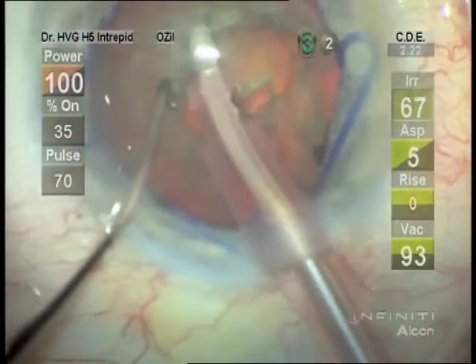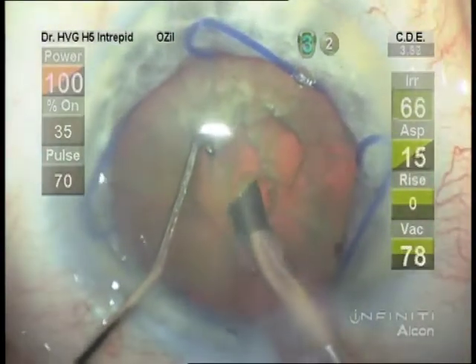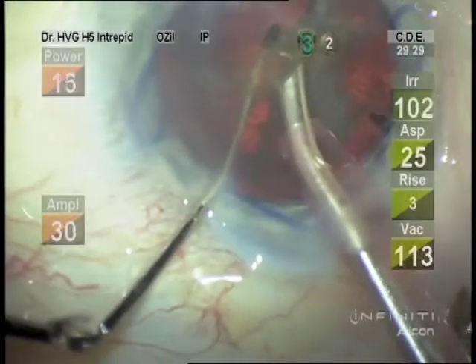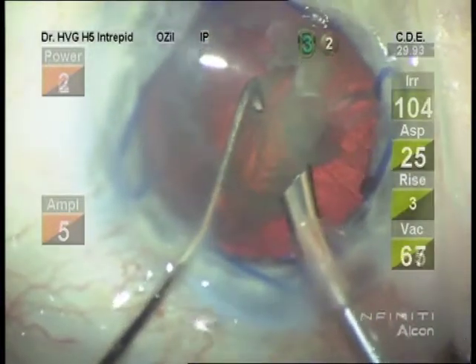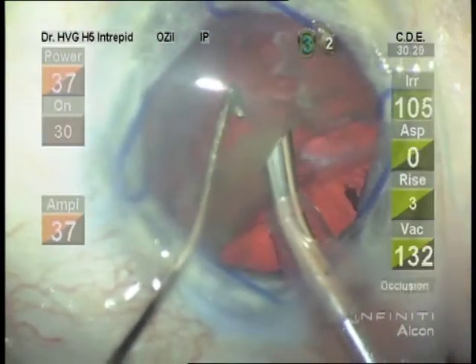So we have a nicely dilated pupil now for pretty straightforward phacoemulsification. Certainly different than the pupil we started out with.